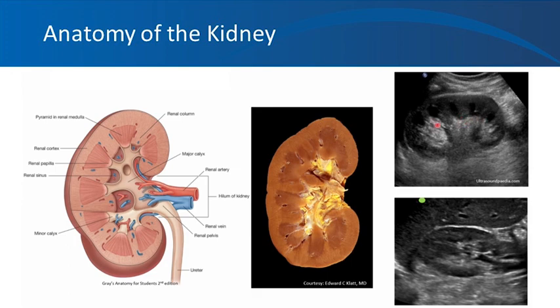And the sinus fat is the most echogenic structure inside the kidney, and the collecting system appears as a hypoechogenic structure. And it's pretty much similar to cortex in terms of echogenicity. And usually collecting system is not black unless there is hydronephrosis. And here you can see the transverse view of the kidney, pretty much same thing.